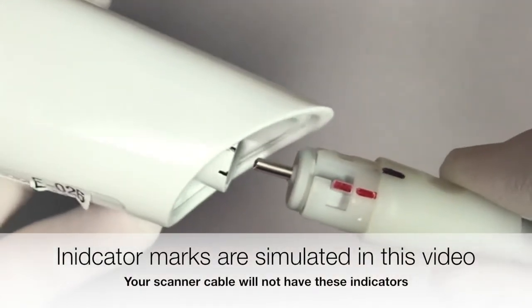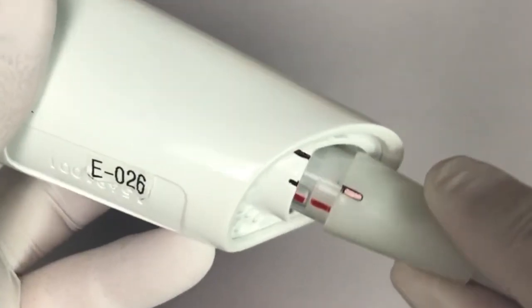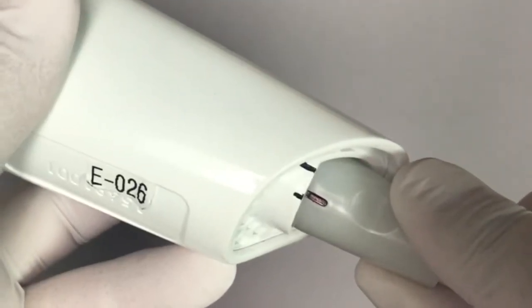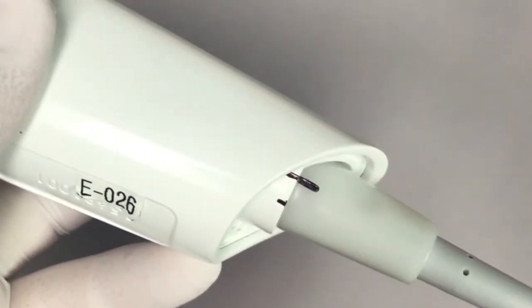Insert the USB cable base into the back of the Planmeca Emerald Scanner. Align the long notch of the cable to the short notch of the back of the scanner. Turn the base of the cable clockwise to the long notch, locking it into place.